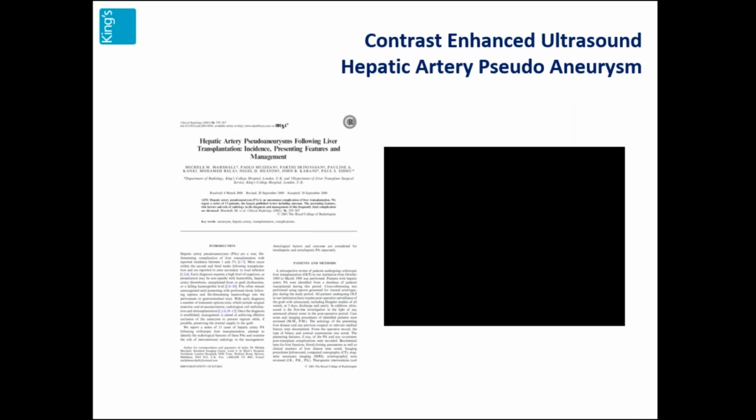Look at it if you've got inpatients with issues with vascularity and liver transplantation, how you can give an intensive care unit point of care answer to this. And also consider extending this practice to your pediatric patients, because remember, Lumason is licensed in the United States, and more people use it here in Europe for assessing focal liver lesions in children.